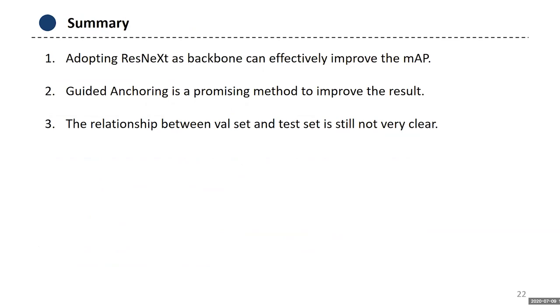In summary, we find that adopting ResNeXt as backbone can effectively improve the mean average precision, and guided anchoring is a promising method to improve the results. But the relationship between the validation set and test set is still not very clear.